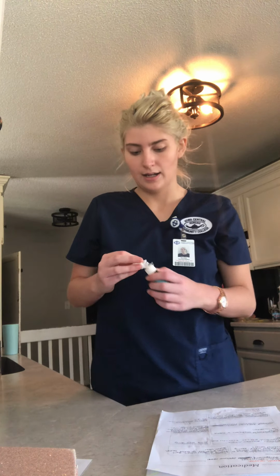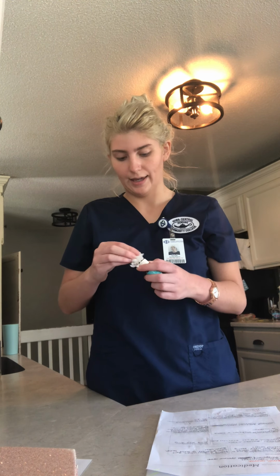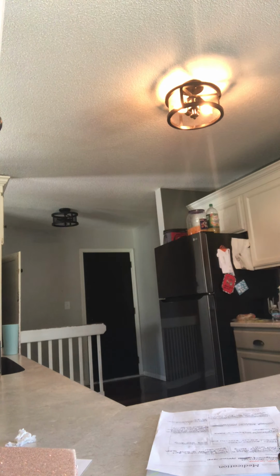To do that, you need to determine which needle and syringe you need. Needle size for an intradermal injection is 1/4 to 5/8 of an inch, and your syringe can be in tenths and hundredths of a cc or ml. And then after you do that, you can get an alcohol swab and clean off the rubber part of the vial. And then you get your syringe.